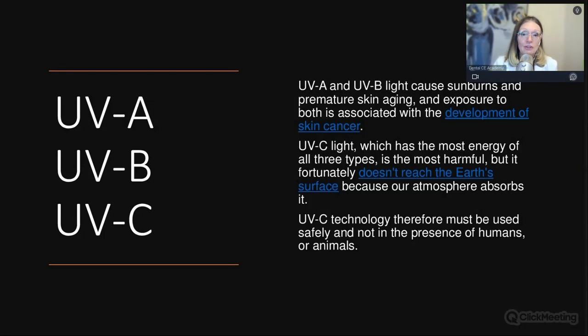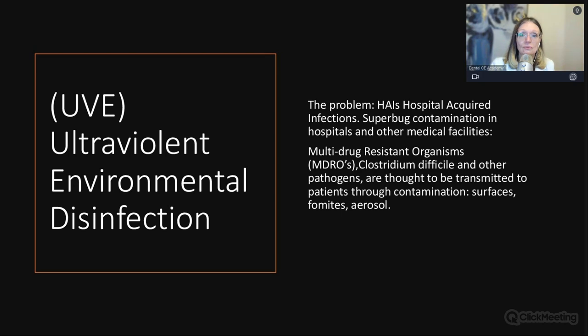But it has to be used safely, which Danny will discuss, and not in the presence of humans or animals. So you aren't going to be in a room when UVC germicidal radiation is taking place for disinfection. And many of those devices will have safety features, which she will talk about. They may switch off if somebody walks in the room. There are apps, etc.